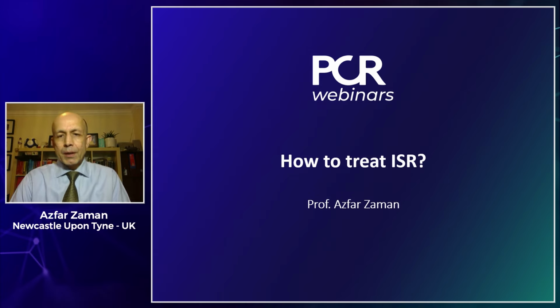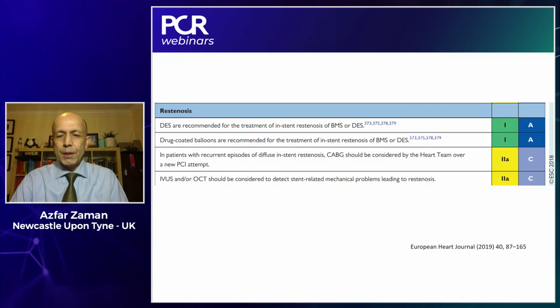So two great cases, and what they show is not only focal and diffuse stenosis, but they also show us that the timing is unpredictable. Sometimes you can get ISR immediately. Sometimes, as we've seen and you'll see later on, it can develop over several years. So how to treat ISR?